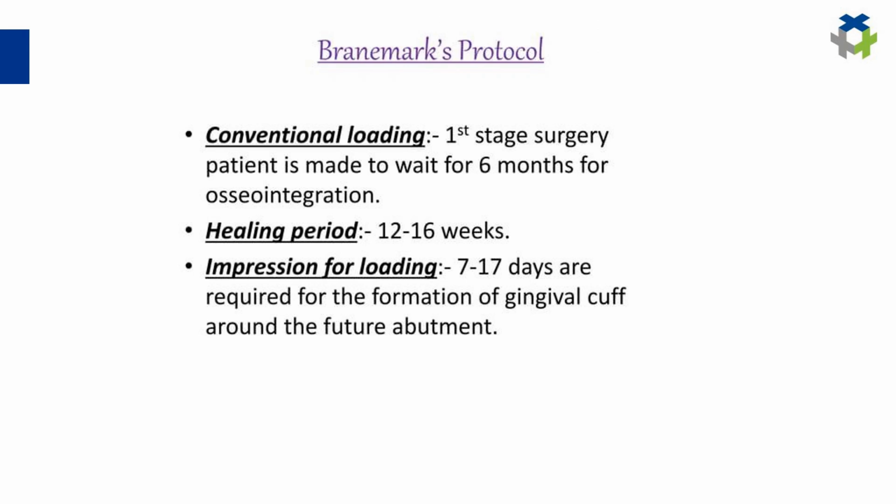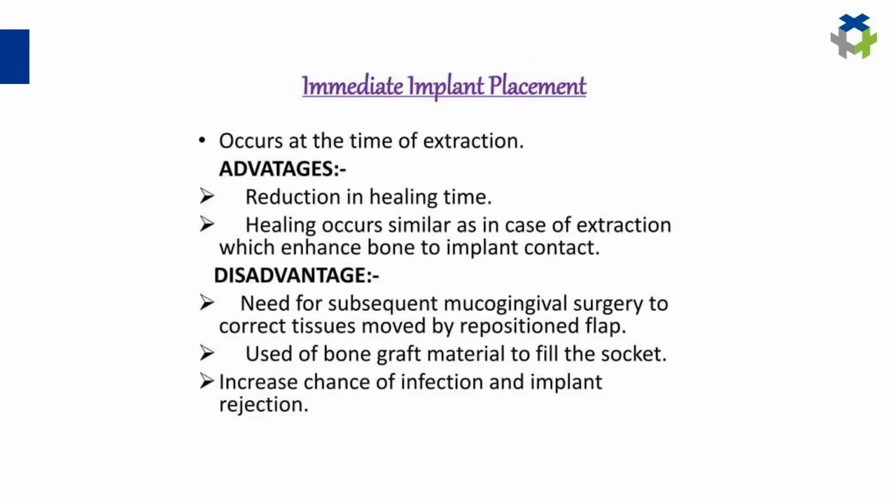Brånemark protocol, conventional loading. The first stage surgery, the patient is made to wait for 6 months for osseointegration. Healing period is 12 to 16 weeks. For the impression for loading, 7 to 17 days are required for the formation of the gingival cuff around the future abutment.